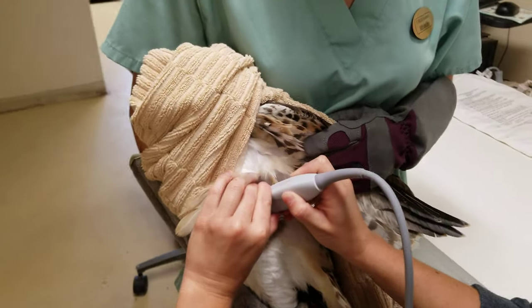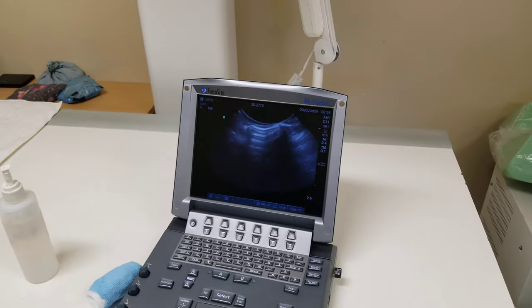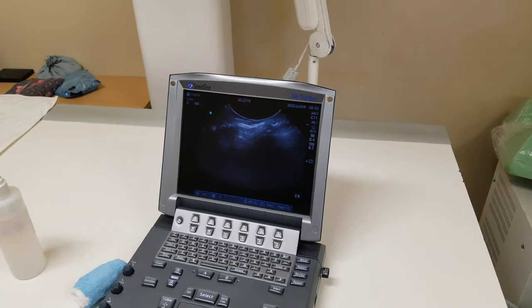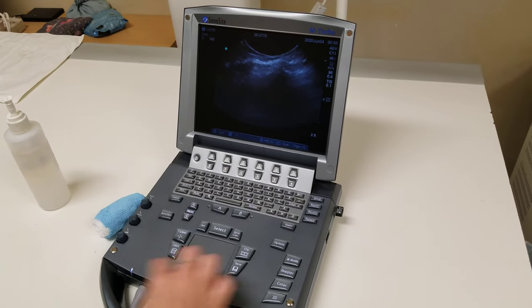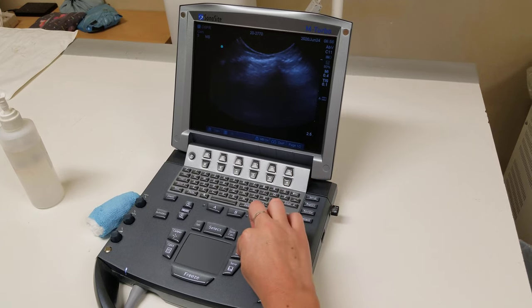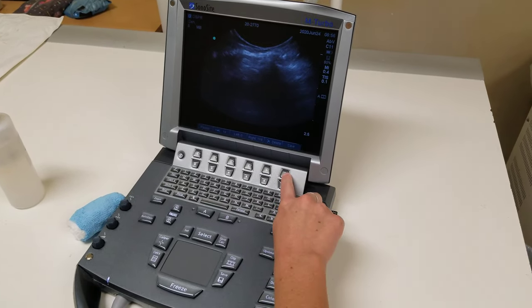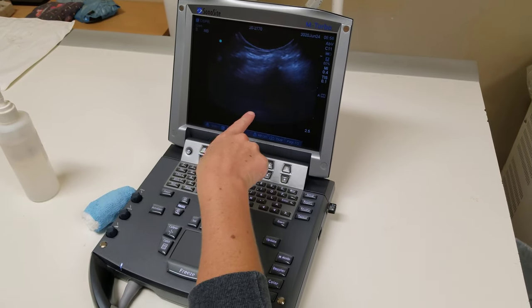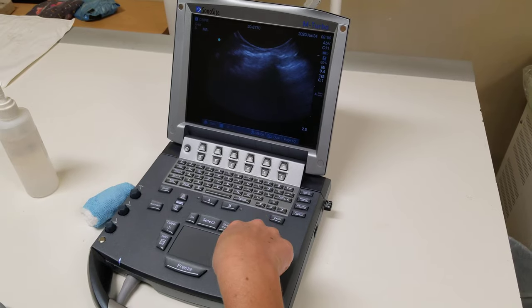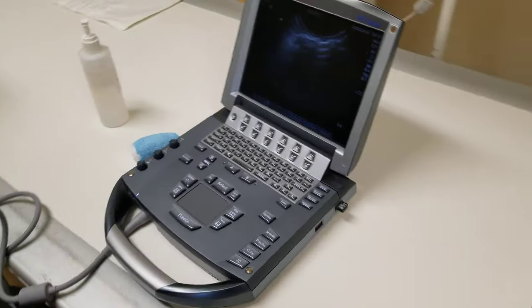We scan ventrally until we lose our gator sign, then come back up dorsally again. Then we hit clip to save the last 10 seconds of what we've scanned. Once you hit clip, you'll see the save sign — you've got to push this button to save your video clip, and then it will show you the last 10 seconds that you ultrasounded.